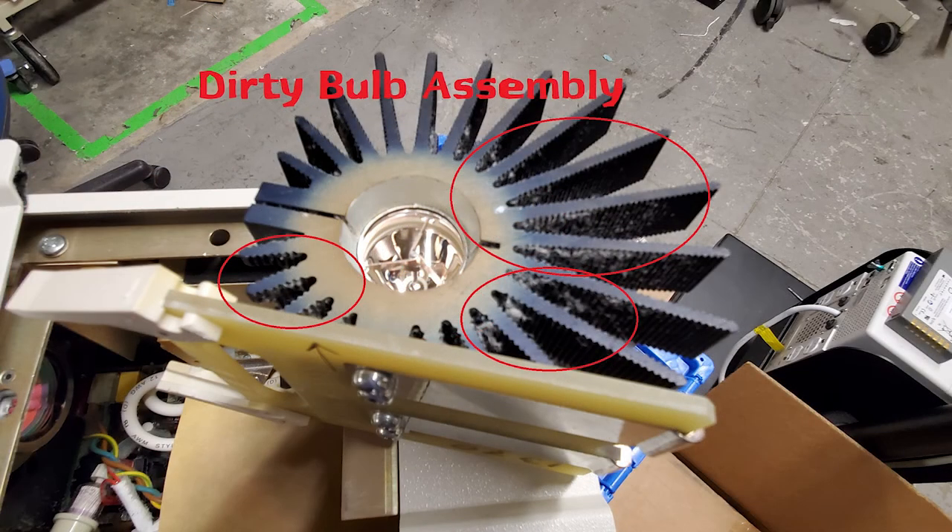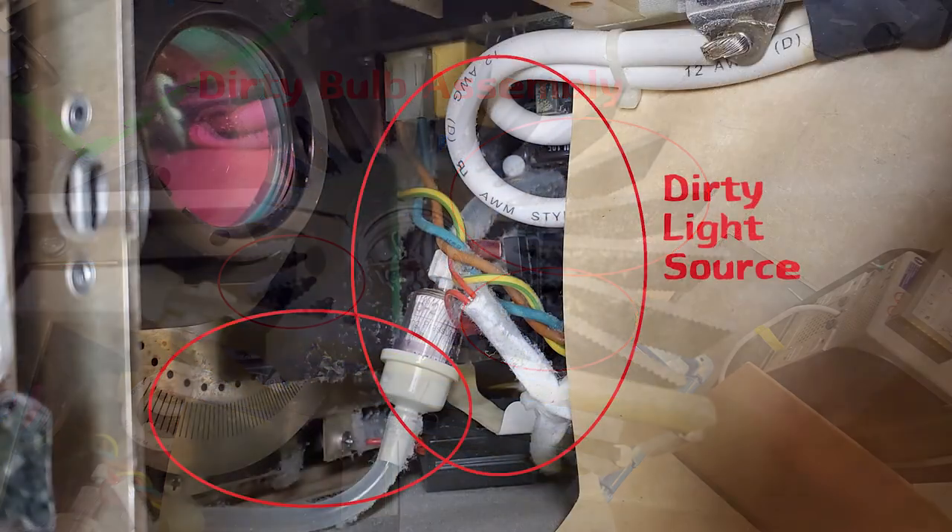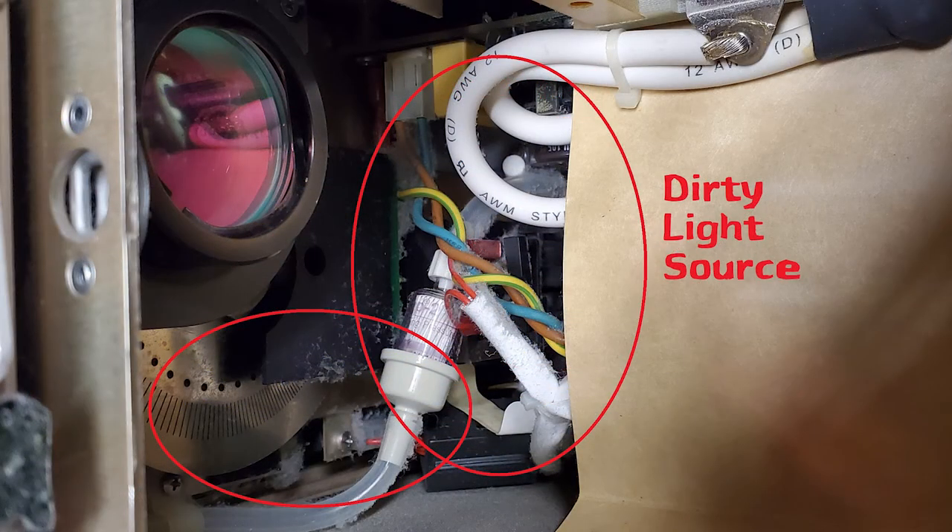Besides anomalies created by the depletion of the anode and cathode, there are other things that can dramatically reduce bulb life. Here's a bulb assembly with probably three or four hundred hours on it that hasn't been cleaned recently. If the bulb is dirty, you can bet the inside of that light source is also dirty. Make sure you clean the fans, the optics, all the cabling, and especially the power supply.